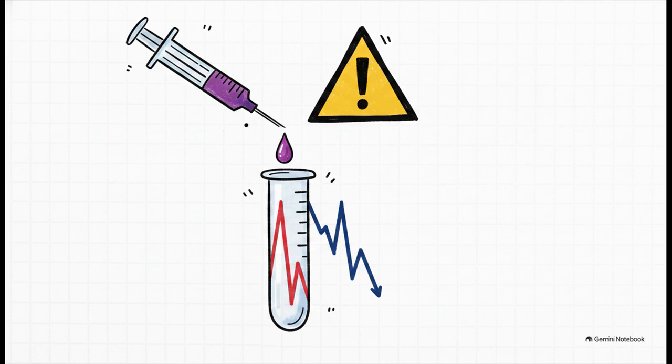Imagine a phlebotomist draws the purple EDTA tube before a chemistry tube. That invisible EDTA carryover on the needle, it introduces excess potassium into the next tube. And because EDTA chelates calcium, it also binds up the calcium in that second tube. If you look at the patient's chart later, it'll show a fake, totally dangerous potassium spike and falsely decreased calcium and magnesium. A perfectly healthy patient could literally be treated for a heart-stopping potassium overdose, entirely because of the order the tubes were drawn in.